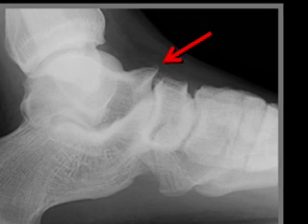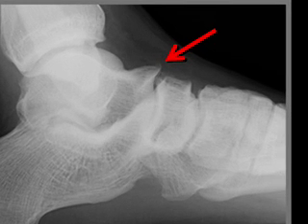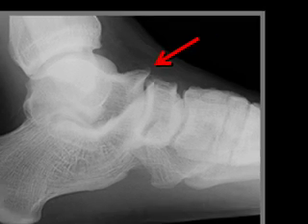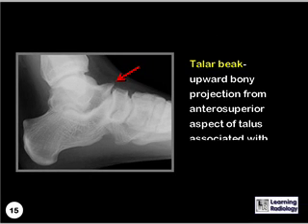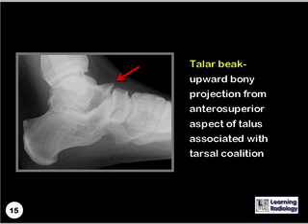What sign is this? It's a talar beak, which is that upward bony projection from the anterosuperior aspect of the talus that can be associated with tarsal coalition.